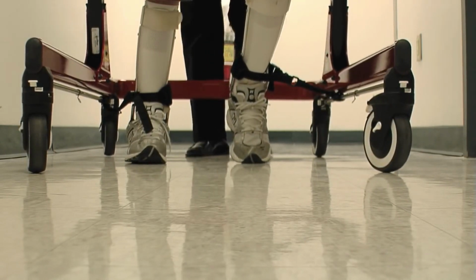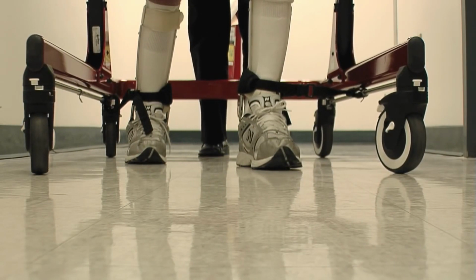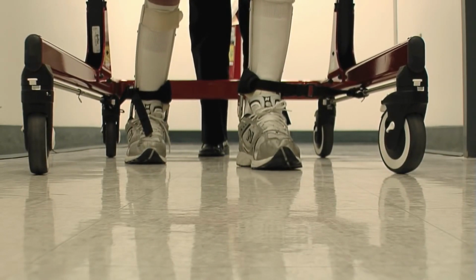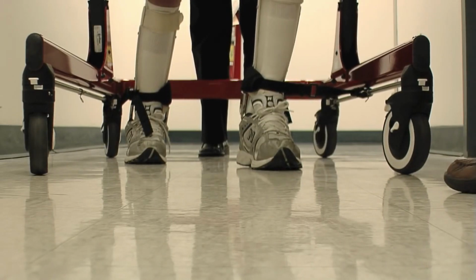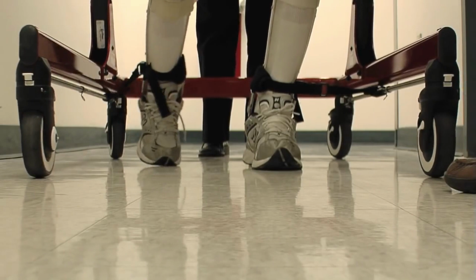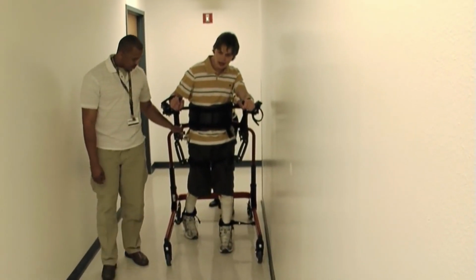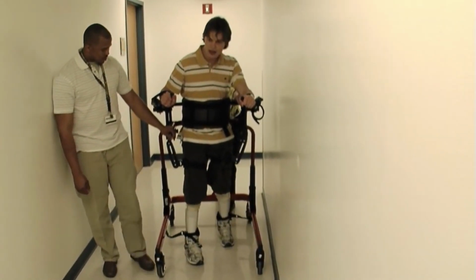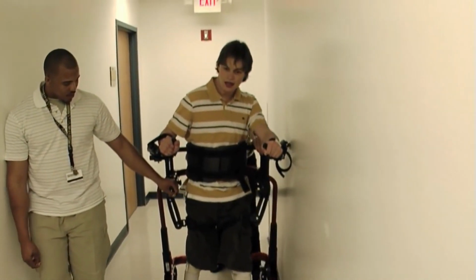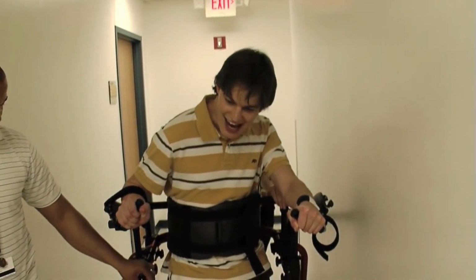What we're trying to do with Sean is to get him to relearn how to control his own movements. When we first started working with Sean, we had him on the treadmill so that he could re-pattern just the basic leg movements, so that he could remember sort of how to reciprocally step one foot after the other, and now he can really do that. We don't have to move his legs for him at all. But what now he's having a hard time with is learning where to put his body in space so that he can shift his own weight and learn to propel his own body. So that's really sort of where we are now.